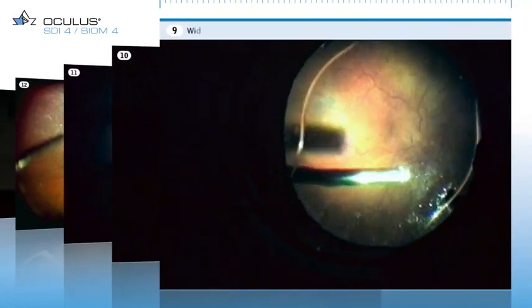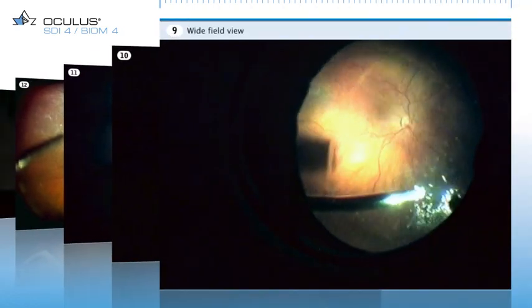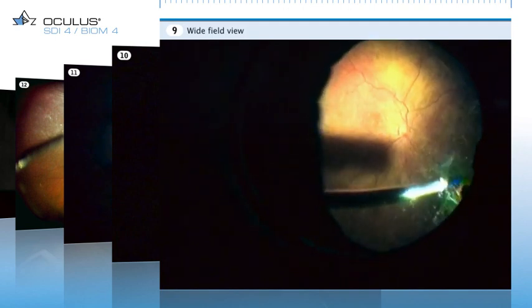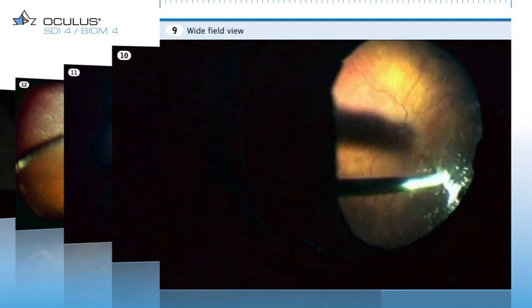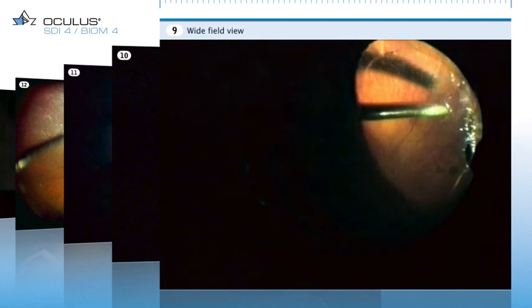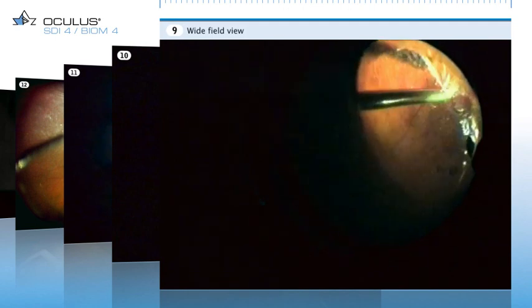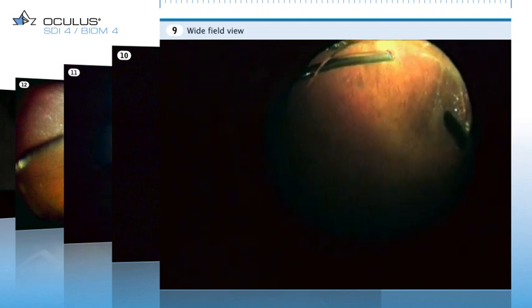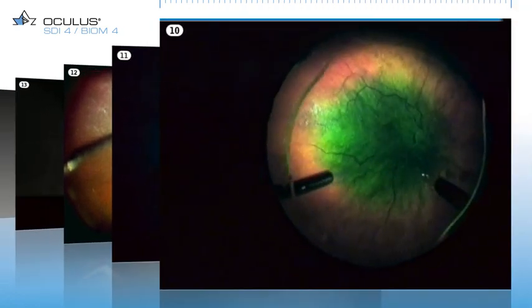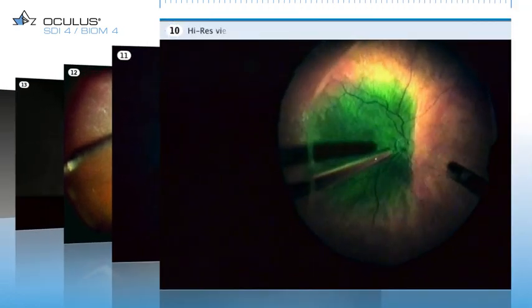You watch now the procedure for peripheral vitreous removal. The front lens used here gives a field of view of the fundus of approximately 120 degrees. This operation was performed using a high resolution lens.